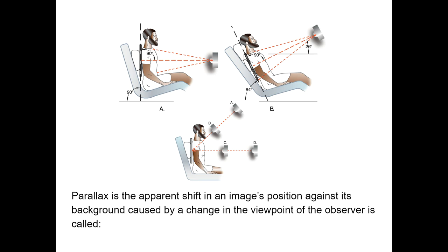These angles, 26, 64, are meaningless. We don't have angles. Rule of thumb, angle down more than you think you need to. Always look at your image when it comes out. If the ribs, or better yet the clavicle, are above the apices and straightened out instead of a V, that's a repeat in most people's world, even though you didn't cut anything off.